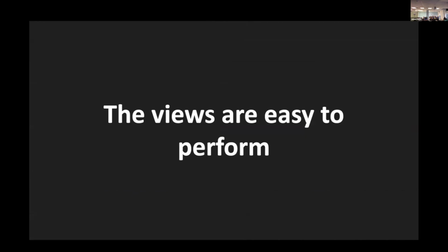All right, and this absolutely changed management, and it wasn't particularly difficult to do. All right, I was doing my normal views when I picked up on this. All right, and I explored a little bit more on some kind of easier views that we can do, and this completely changed management for sure. All right, so first point, the views are easy to do. You can pick up on a lot of these on just the normal views that you're doing.